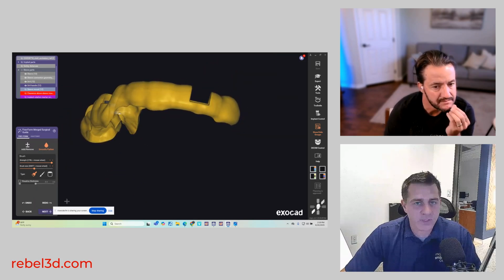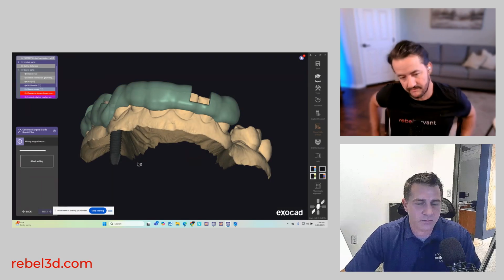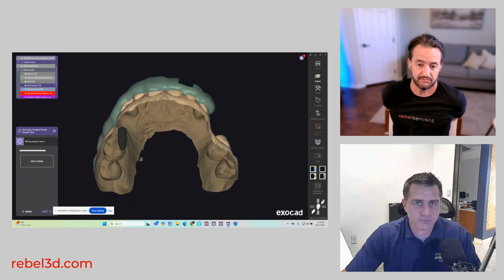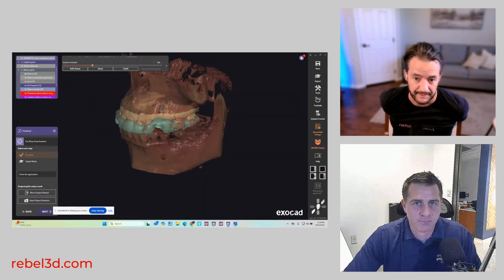And if you're happy with everything, then you're done. And as a general dentist, how long did it take you to learn Exoplan, and then how many cases have you designed, and what's your current design time per case?